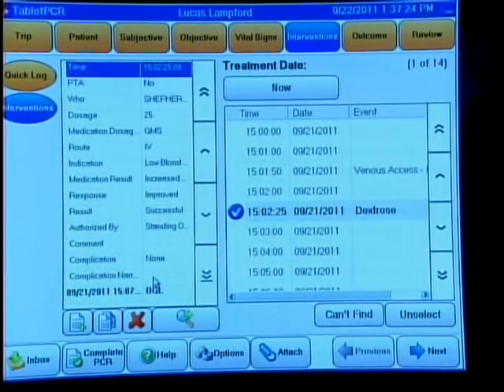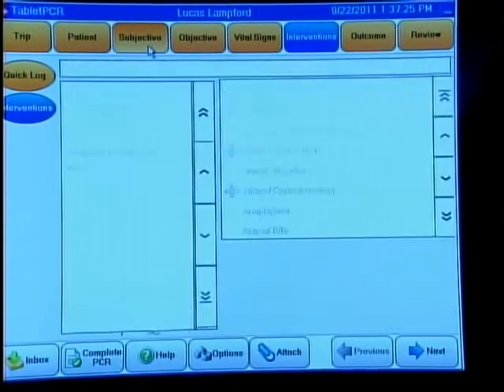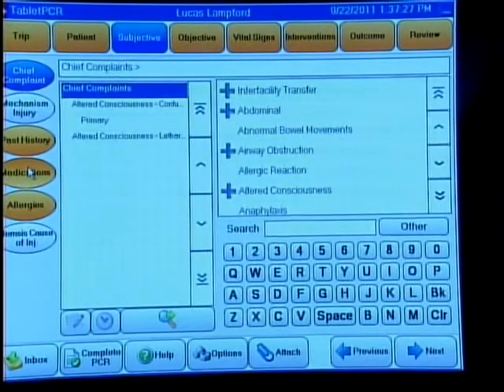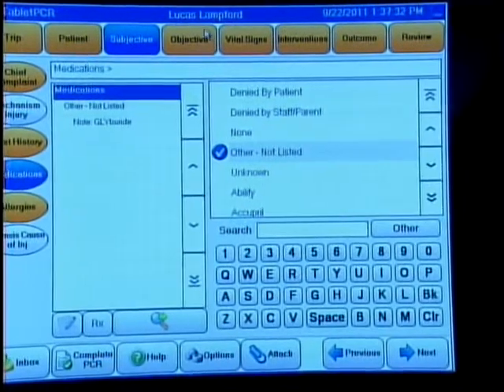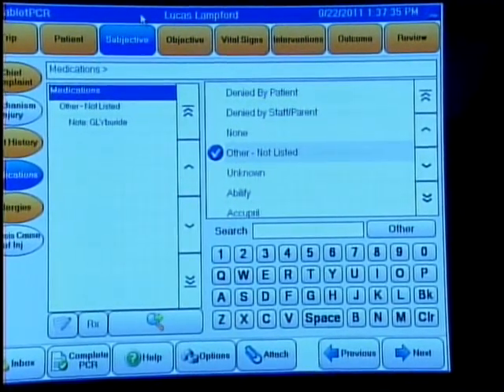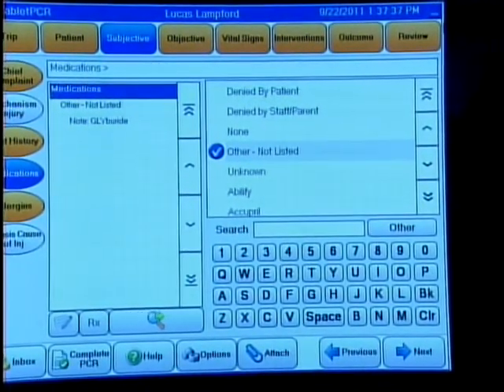After he wakes up, we're able to establish what kind of medications he takes, any specific medical history that he has. Lucas has decided that he does want to go to the hospital, so we're going to take him to Newark Beth Israel.